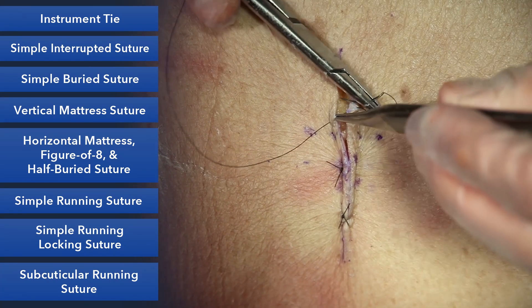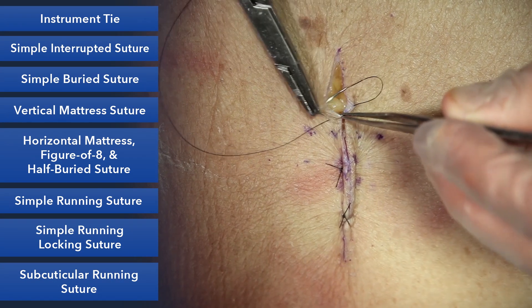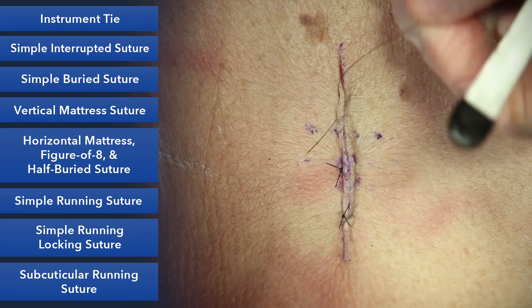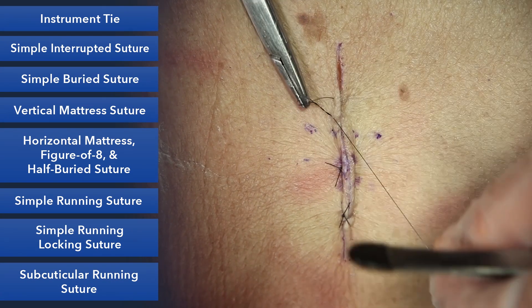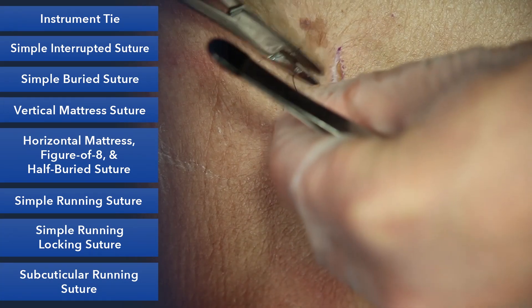Then come back on the other side, again out like you would in a normal horizontal mattress. So effectively it's your horizontal mattress, but half of it is buried — hence the name the half-buried horizontal mattress. When you tie this, it'll secure the skin and you only have suture marks on one side.